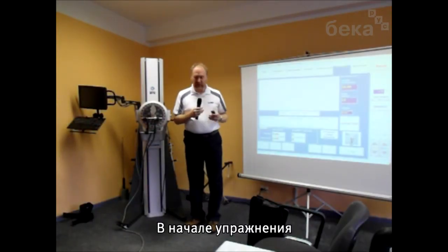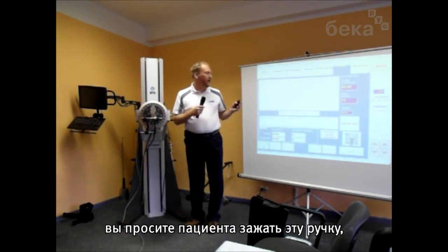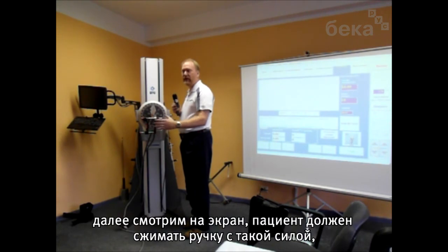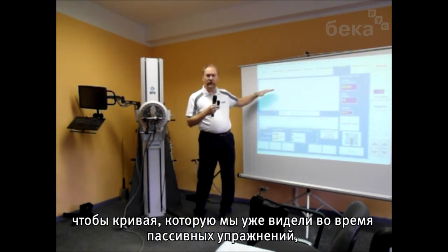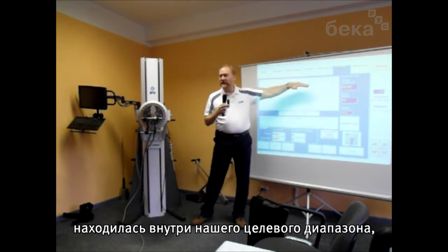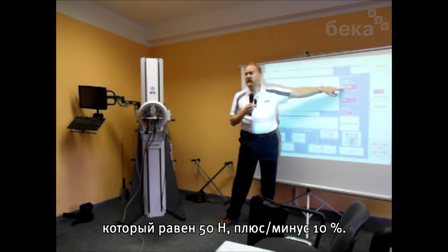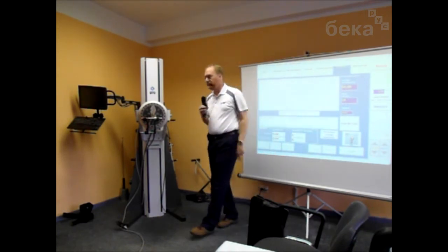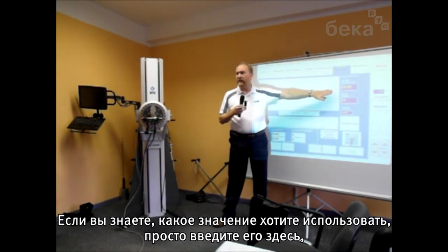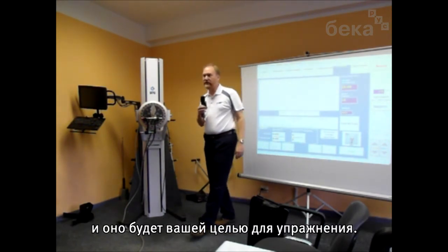So again, when you begin the exercise, you'll ask the person to exert force against the handle. In this case, we're going to do a grip, and they'll watch the screen and just exert enough force so that when they build that torque curve, very similar to what we were looking at in CPM, they'll be able to keep it inside that target range, which will be 50 newtons plus or minus 10%.